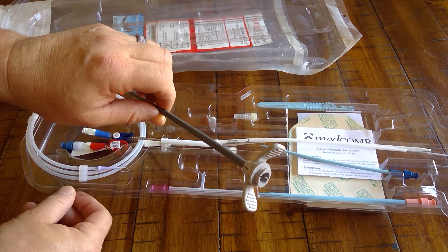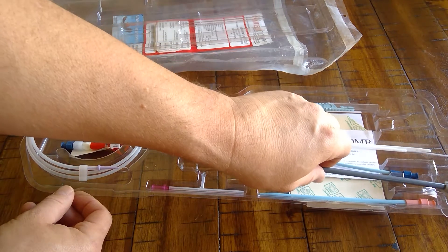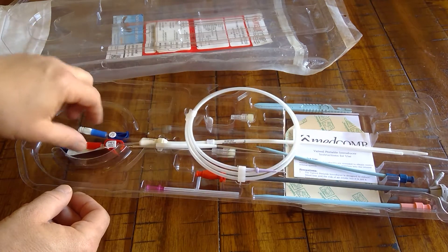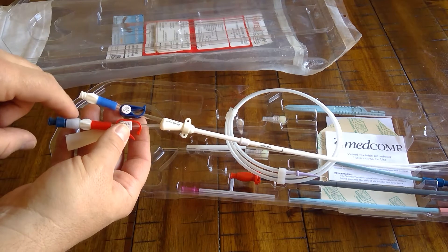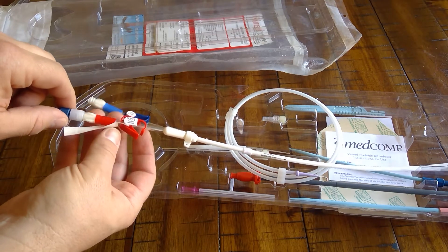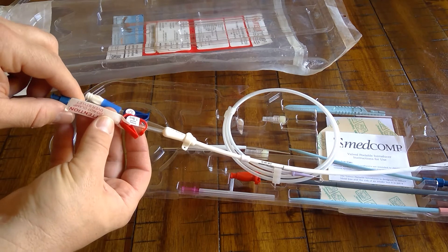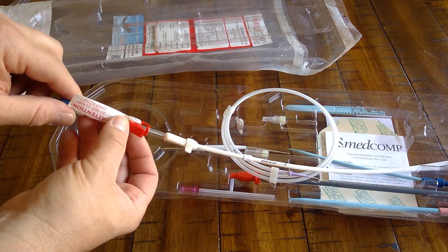Here is an air guard sheath, which is a valve peel-away sheath that the catheter gets inserted through. The valve minimizes or eliminates the risk of pulmonary embolus or air embolus during the insertion process. When you take the catheter out of the package, you'll notice it has blue and red lumens like most other catheters. This one has a stiffening stylet in the red lumen with a tag.